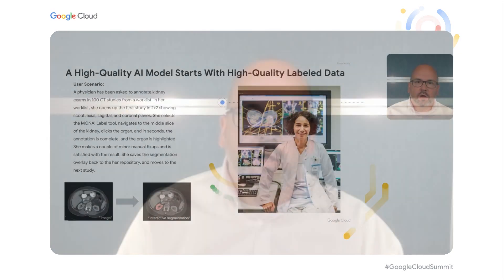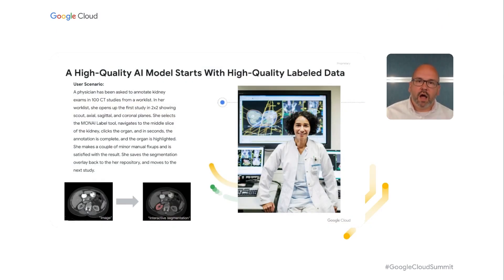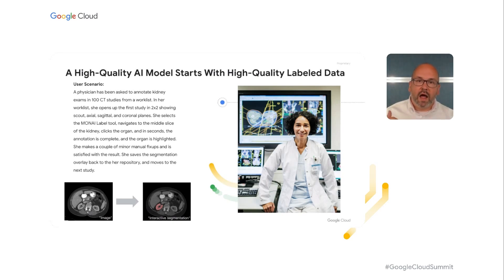It bears repeating: a high-quality AI model starts with high-quality labeled data. Imagine a hospital where a radiologist has been asked to annotate 100 imaging studies to identify the kidneys. The clinician will open a CT study, navigate to the midway point past the kidney, and using the one-click label tool, click on the kidney and have it selected in 3D space.